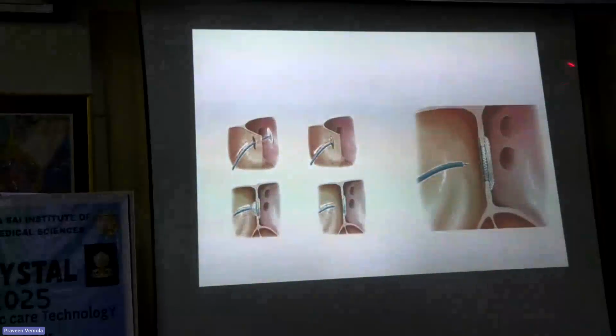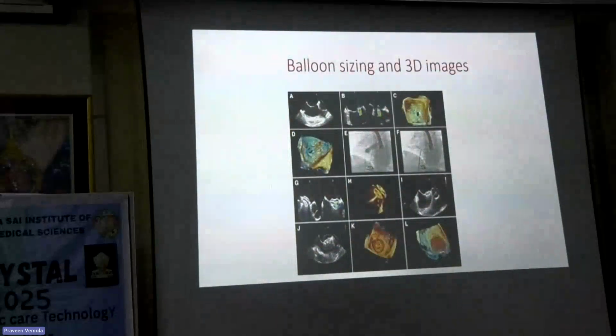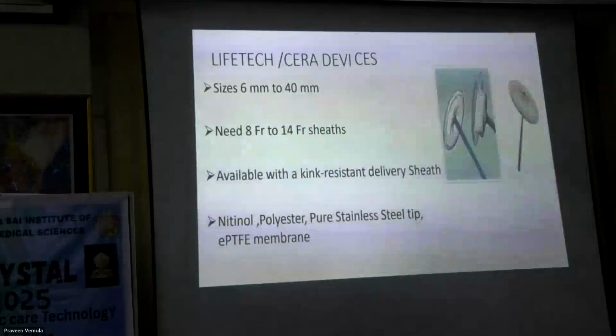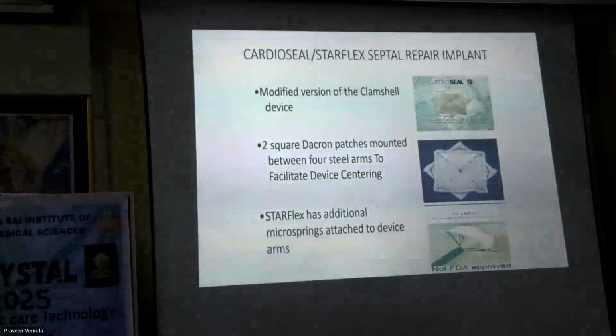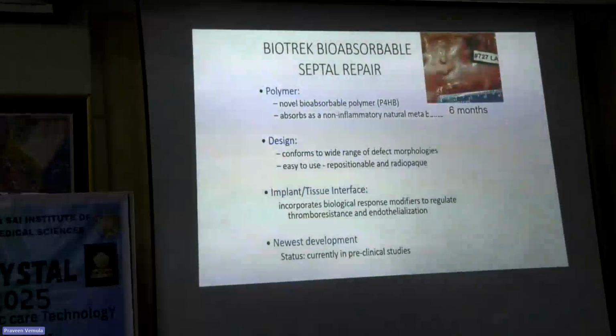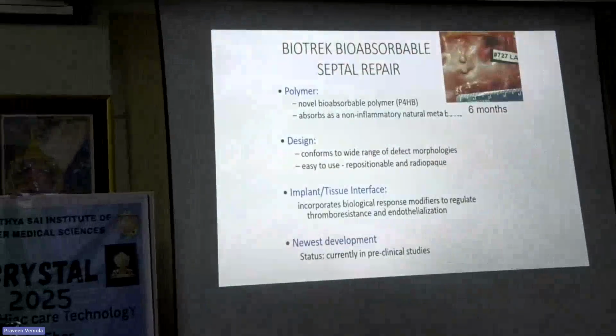The problem comes because these rims get floppy. They get floppy, your sizing may not be correct, which is why TEE plays a very big role. 3D plays a very big role today. These are all names of devices. You don't need to know all of this.